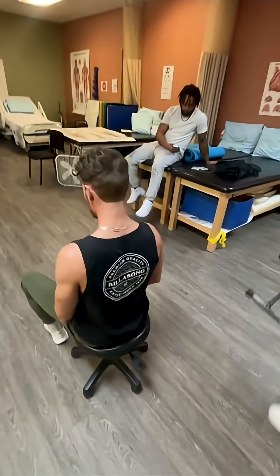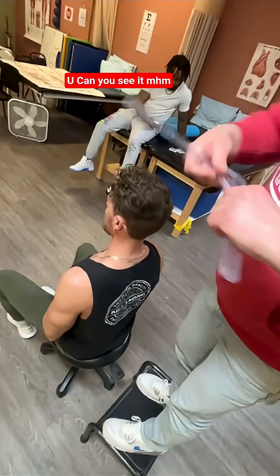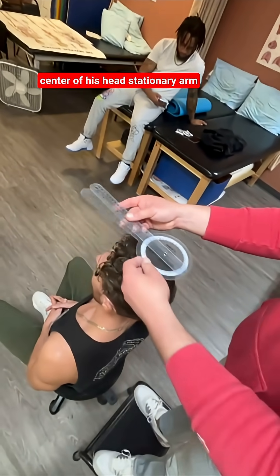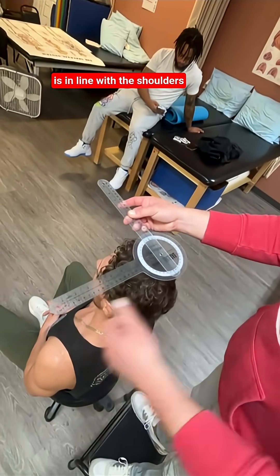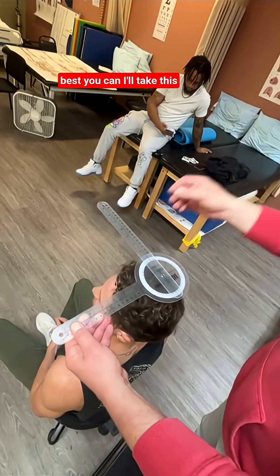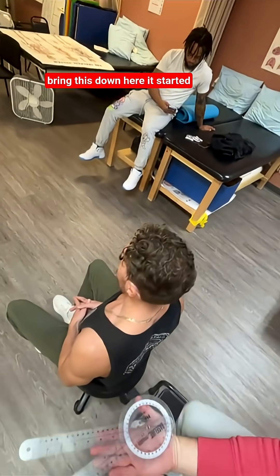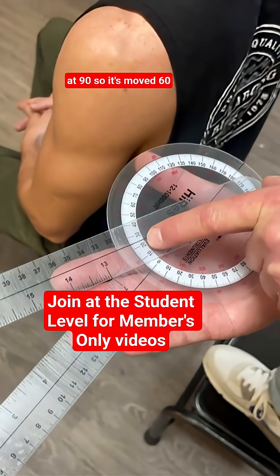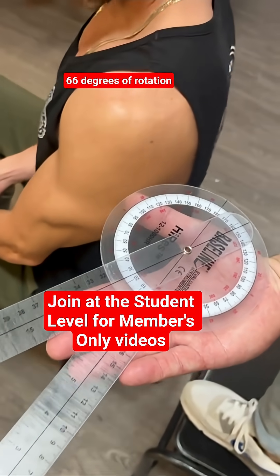Now, rotation. We're at just the center of his head. The stationary arm is in line with the shoulders on both sides. The moving arm is going to be in line with his nose. Look to the left best you can. It started at 90, so it's moved 60 and then six more degrees — 66 degrees of rotation.